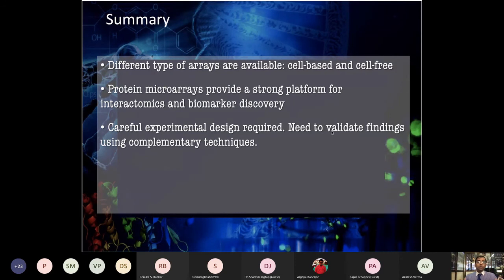In fact, the large biomarker discovery programs start with, let's say, we want to work on one of the cancer types and want to look for autoantibody response. So you start with, let's say, 200 chips, and those can be used for the discovery set. When you are now looking at 30,000 spots printed on the arrays, you are looking for all the 200 patient samples to be screened. After doing the entire screening and analysis, you have found some proteins which are showing good response in different grade-wise comparison.